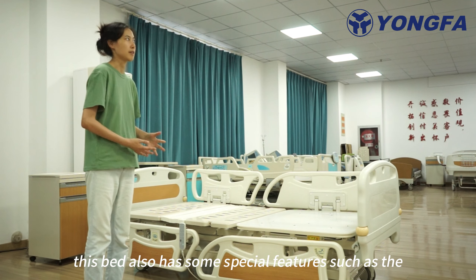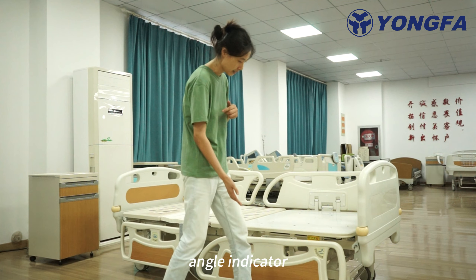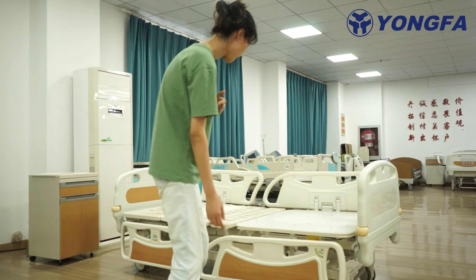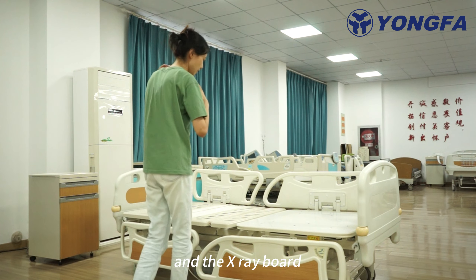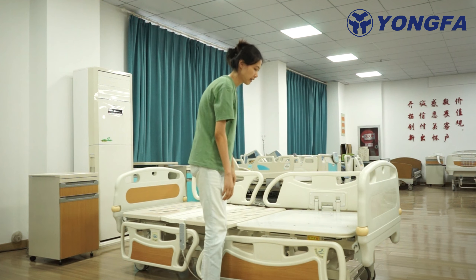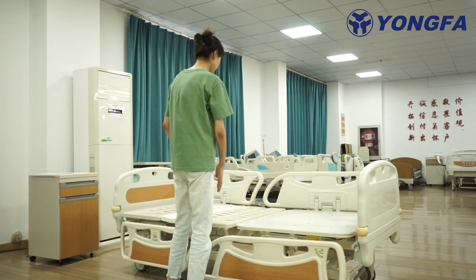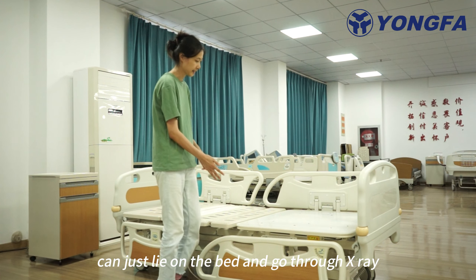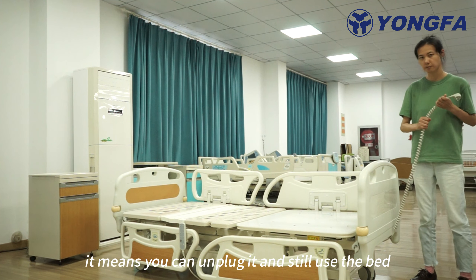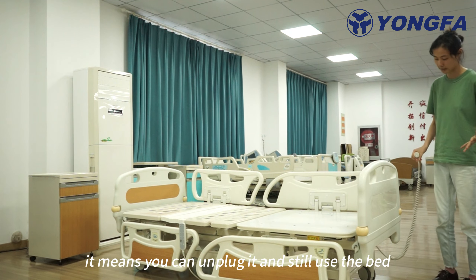This bed also has some special features, such as the angle indicator and the x-ray board. It means the patient can just lie on the bed and go through x-ray. Also equipped with a backup battery, meaning you can unplug it and still use the bed.